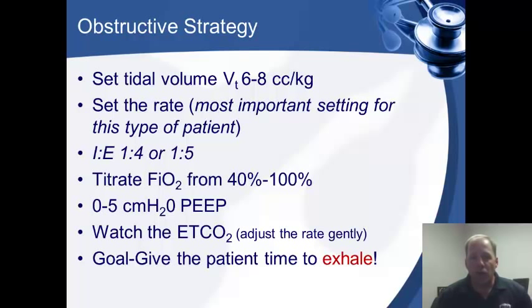Now you want to watch closely as you get these settings going, and you want to watch that end tidal CO2. Make sure it's not dropping too fast. If they're retaining, you can increase the rate, but do it gradually. Don't do it too drastically, like changing a rate from 10 to maybe 14 or 16, because increases in the ventilatory rate at that point are going to shorten the expiration time and potentially going to cause problems for us and drop our CO2 too fast. And you don't want to overshoot that. It's better to be a little bit on the hypercarbic side than it is to be below that 40 because it's a lot harder to get back.